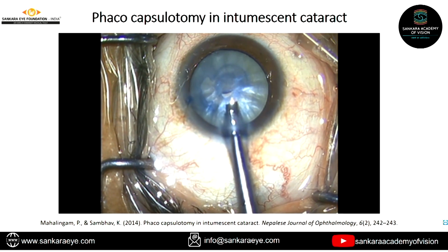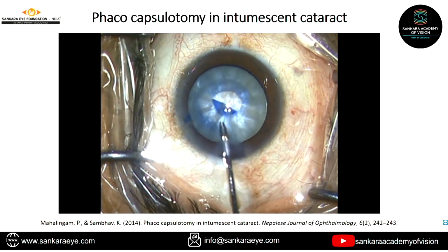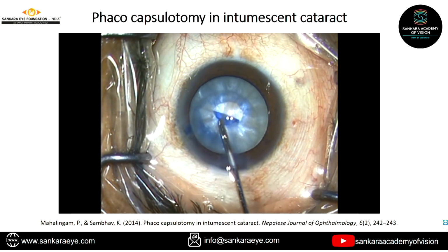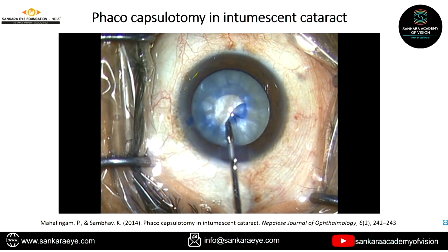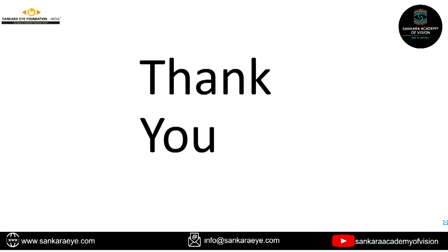And you can just come out very slowly. Then once you get a hold of the rhexis, all the fluid has come out with phaco aspiration in one punch. Then you can always do a very small rhexis initially. Then once the rhexis is completed, you can always go for a bigger one. Thank you. So I think incision and rhexis are very important to do for your phacos.